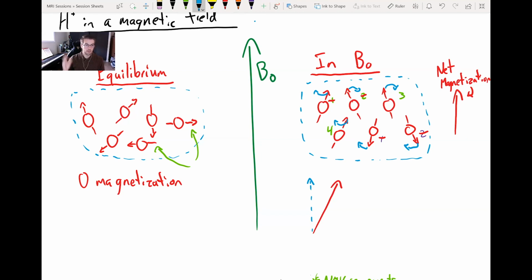So it has some orientation and some magnitude, as every vector does. And then there's also a lateral transverse component, which would be broken down like this, right? So if I had an arrow oriented the other direction, it would have the same blue component vector, but its lateral or transverse component would be oriented the other direction, right?